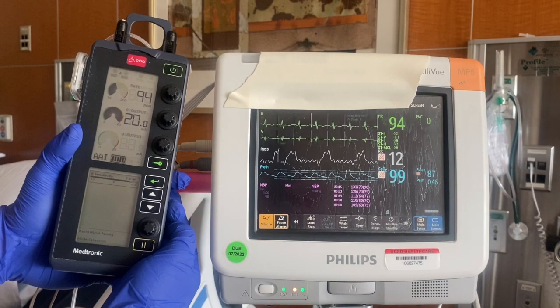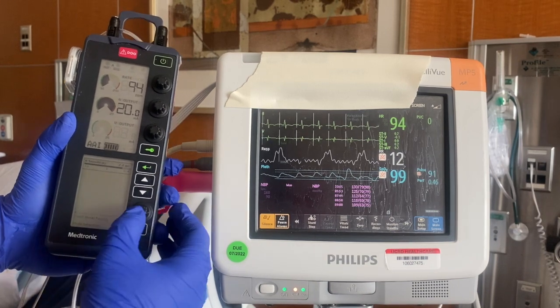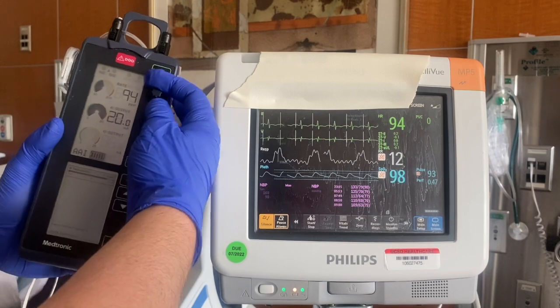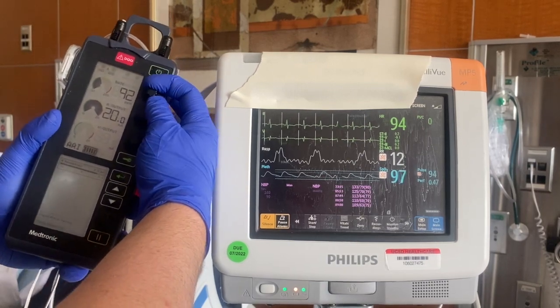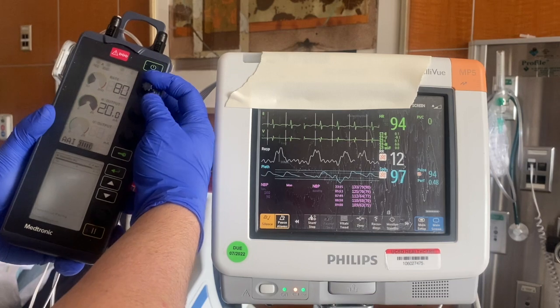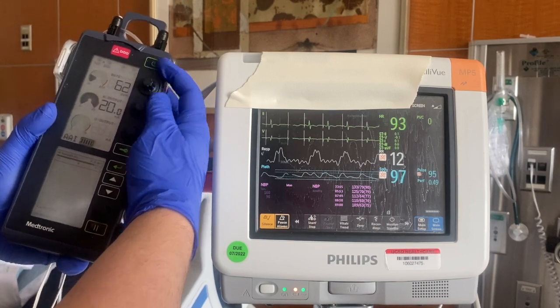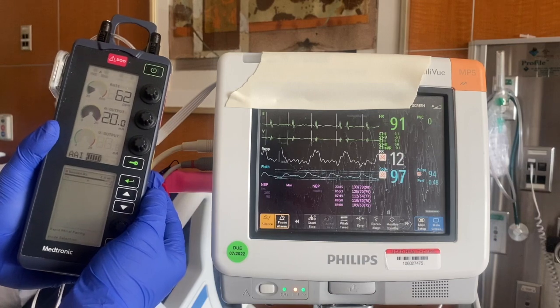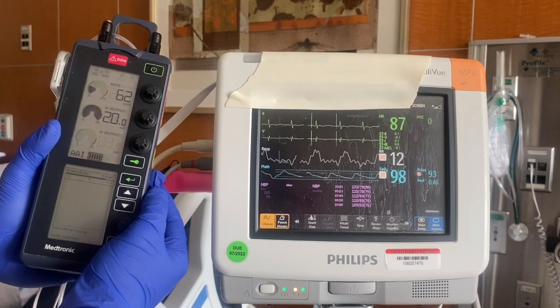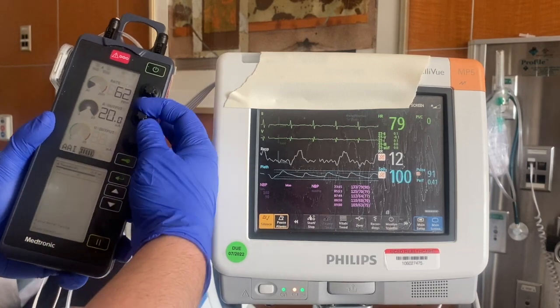Next will be your sensing threshold. You will set the rate at least 10 below the patient's intrinsic rate. Remember, when we looked at the underlying rhythm it was at about 72, so we will come down to a heart rate of 62 on the pacemaker box. At this point we will adjust the output, setting it to 0.1 milliamps.